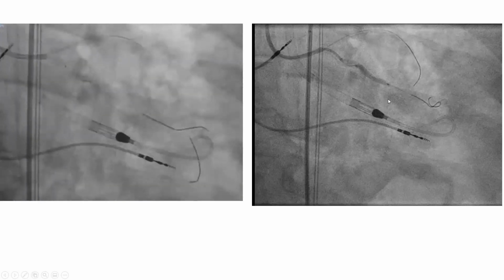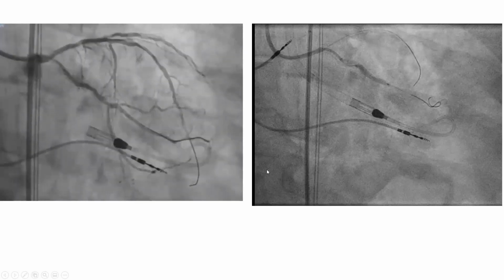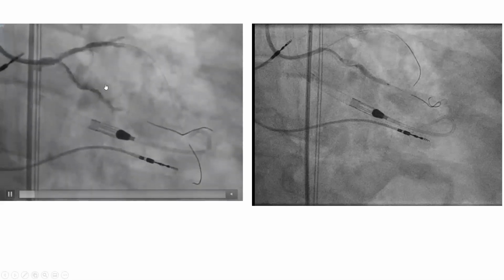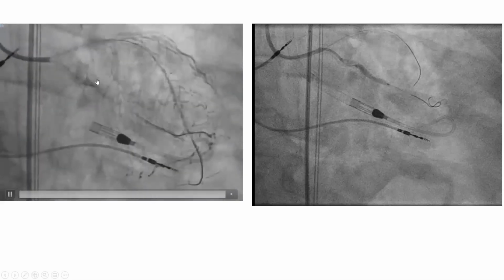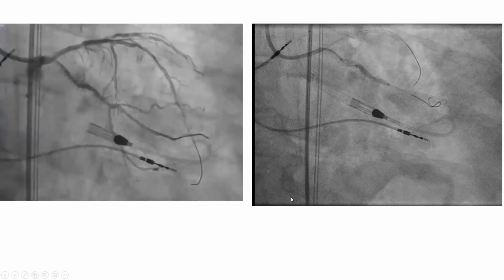Again, there is nothing worse than that guide ventricularization. Try to avoid it. In this 84-year-old man with stable angina, I really would have myself avoided that circ. And as a result, I would have actually avoided support, because this is the only time, interestingly, where you need support. And this is the less important part of our intervention.